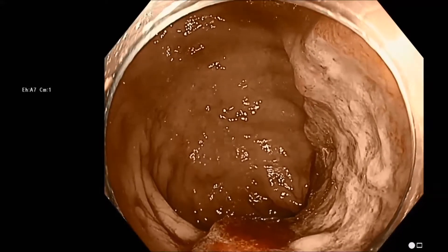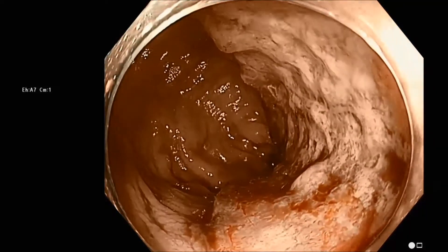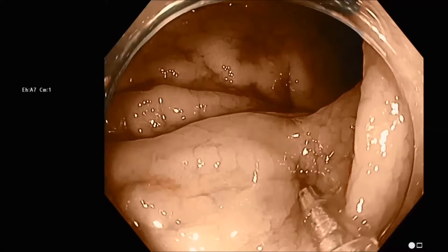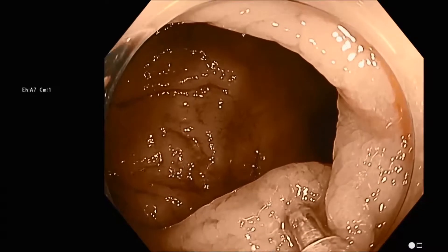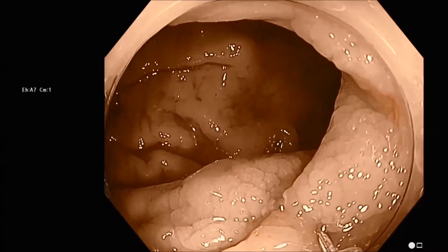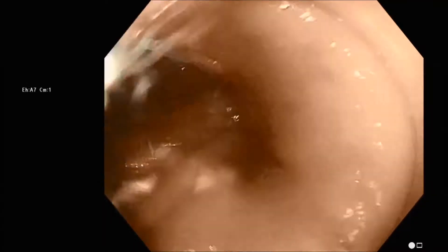Let's demonstrate in real time the marking of a colorectal cancer. You can see a fairly flat colorectal cancer here in the left colon, and the optimal location is distal to the tumor, usually by a distance of two to three centimeters.